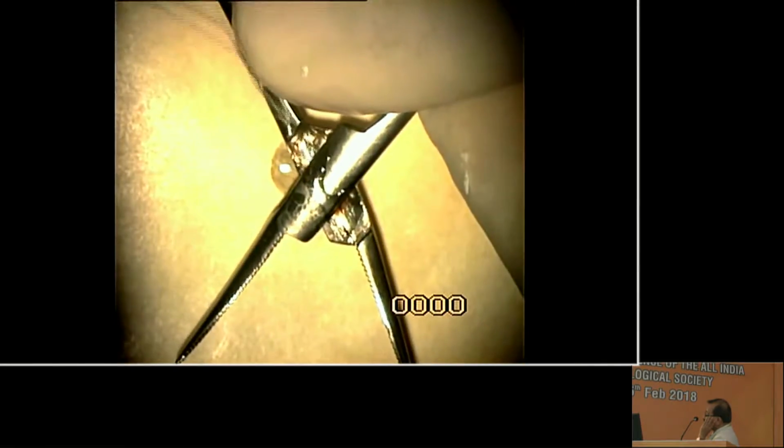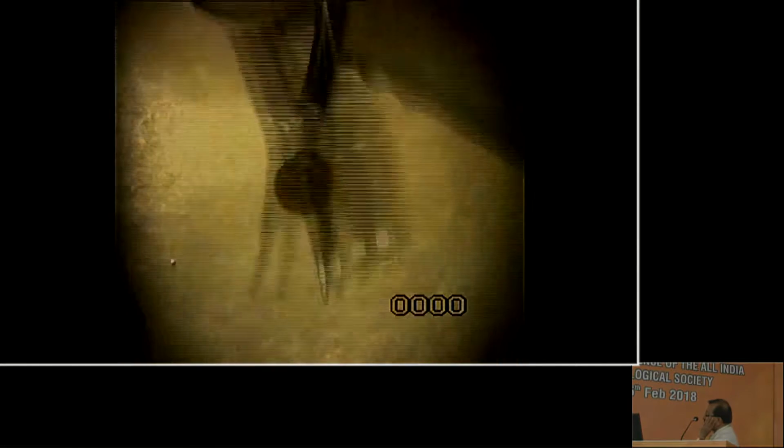Similarly, silicone oil removed after surgery can be used each week on the joints and fulcrum of hinged ophthalmic instruments to decrease rusting, stiffness, and difficulty in opening.